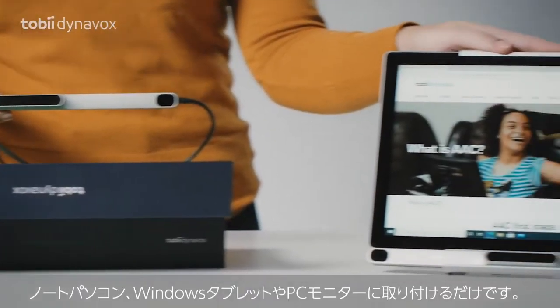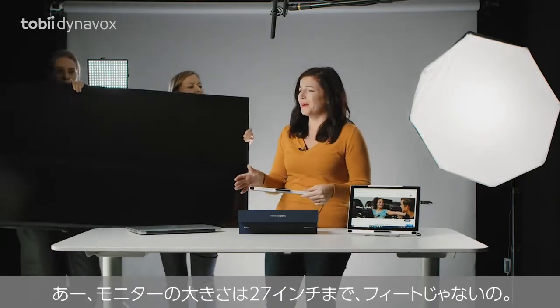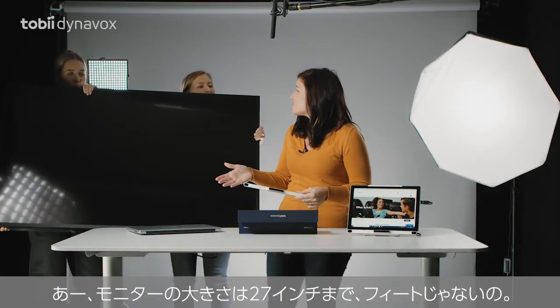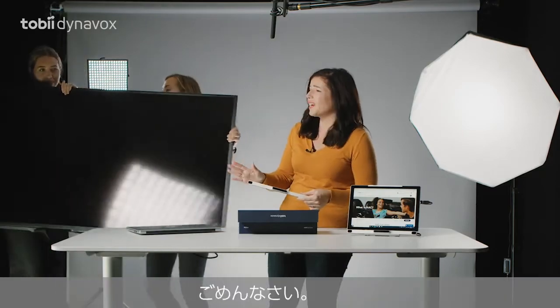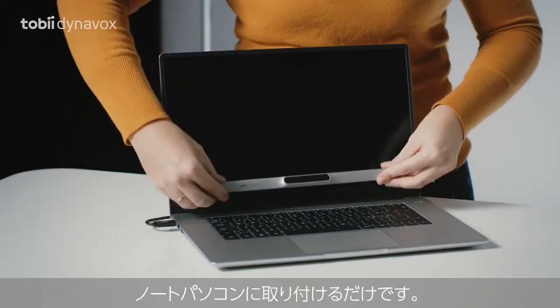Just place it on your laptop, tablet, or monitor. When I said monitor, I meant up to 27 inches, not feet. Sorry. Now that we cleared that up, just plug it in and place it on your laptop, like so.